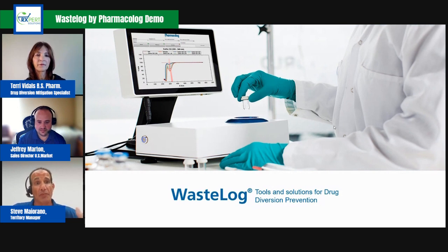It can also be set up for use by pharmacy. So pharmacy does all the assay testing. Now, whether they do that testing down in the procedure area or in the pharmacy or any designated area that they deem, the system is mobile. So they can really perform the test as randomly as they want and wherever they want.